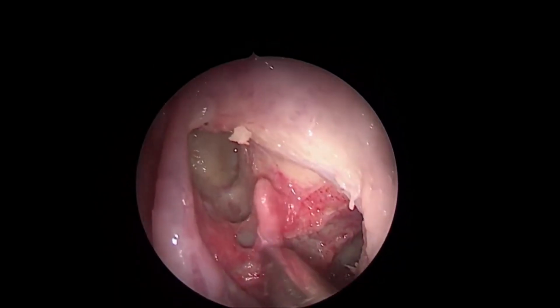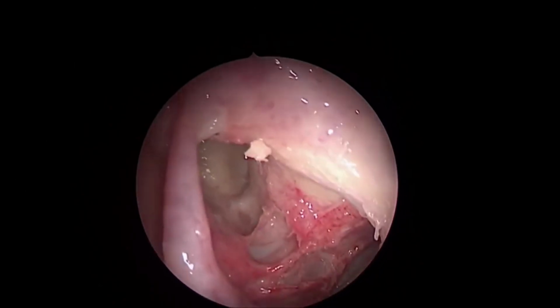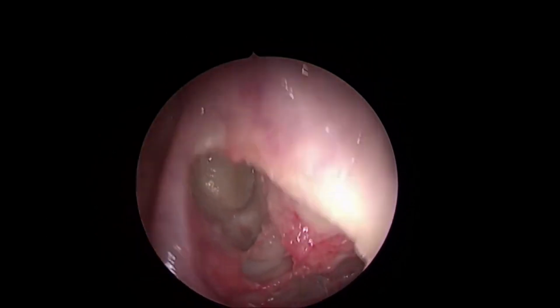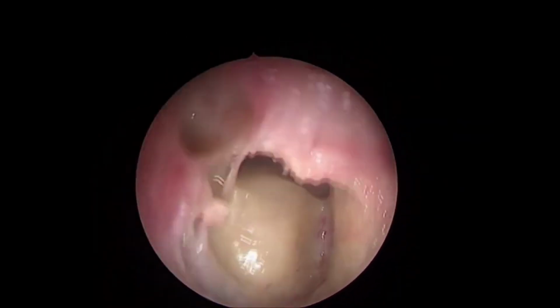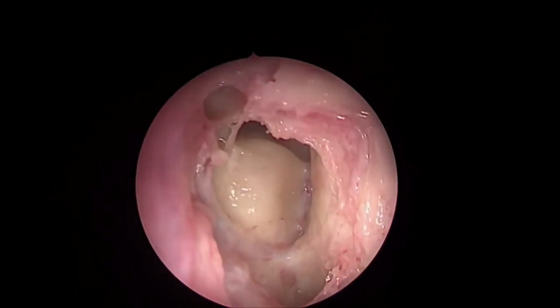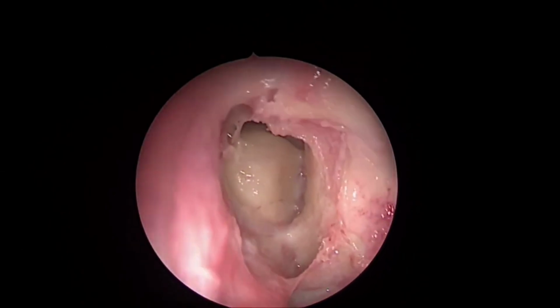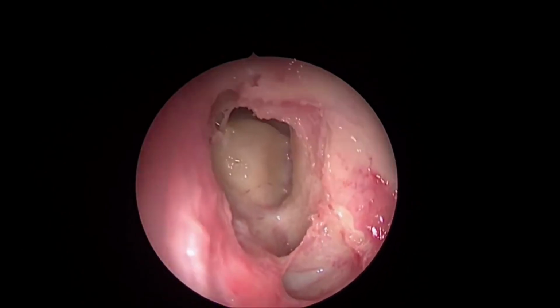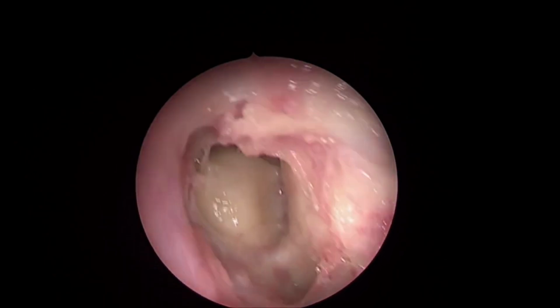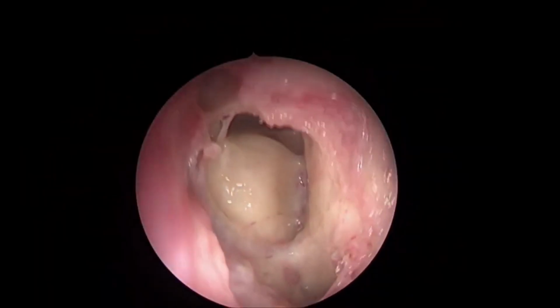totally show. We are here today for all those extended procedures of the frontal sinus. I will show you all 8 types of the Draf procedure today. What we have done already, according to the Draf classification, when you go to the level of the frontal sinus ostium, is a Draf 1. So you have already done a Draf 1. I will show what is 2A, 2B and 3. What is subtotal Lothrop, what is hemi-Lothrop, what is mini Lothrop, what is central Lothrop, and they have their own indications. We have a huge number of cases doing all these variations for particular indications, which I am going to share with you.